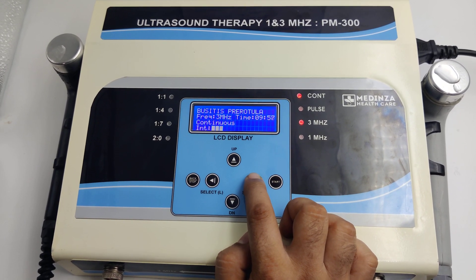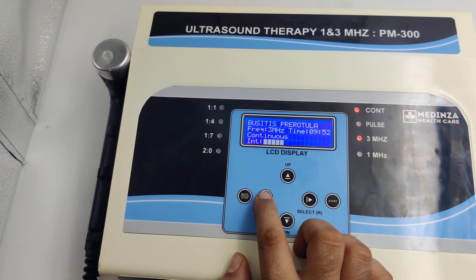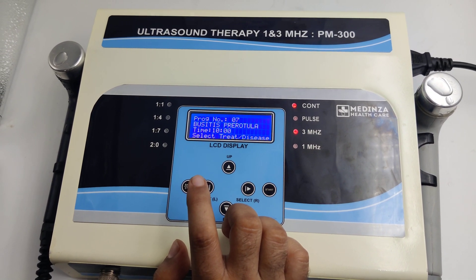Start the program. Increase the intensity as per your need, or decrease the intensity. After the treatment, stop the program.